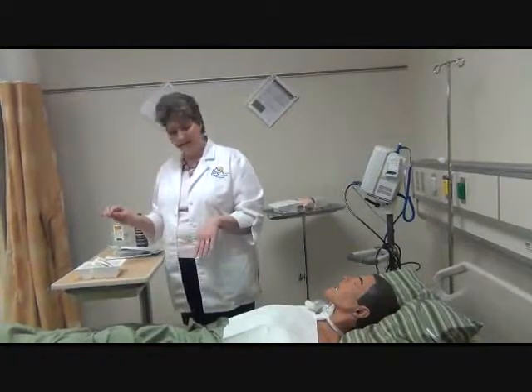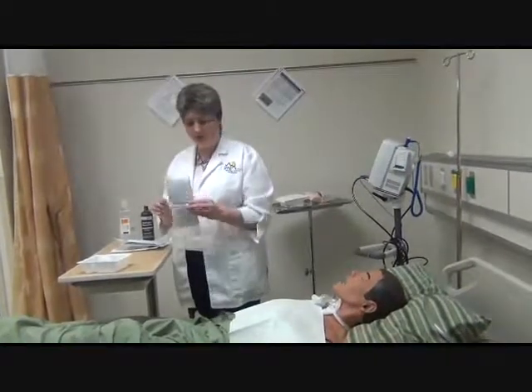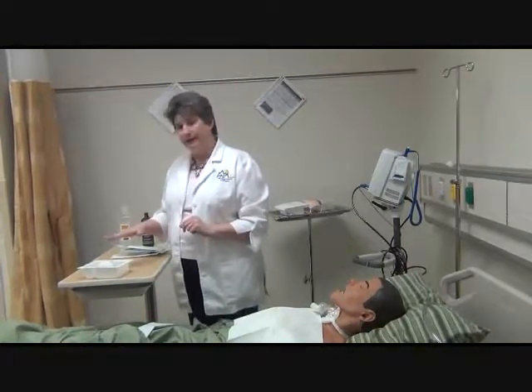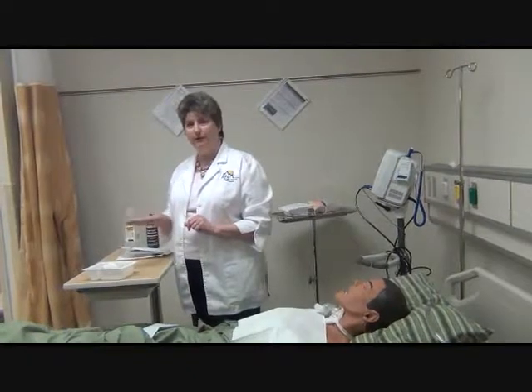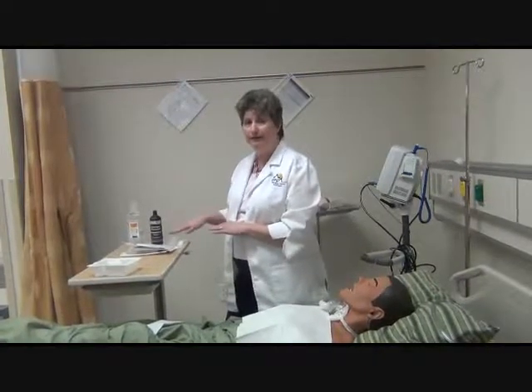So I'm going to open up two pairs of gloves here. With the suction catheter comes a pair of gloves, and there's also a pair inside the trach kit. Sometimes the trach kits also have the suction catheter. We don't have that luxury, so if I know that the patient has to be suctioned, I'm going to open up both my trach kit and my suction.